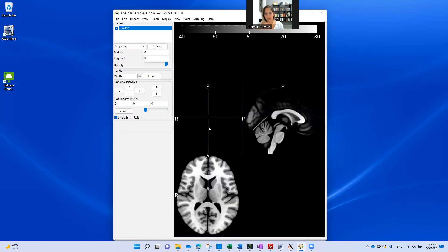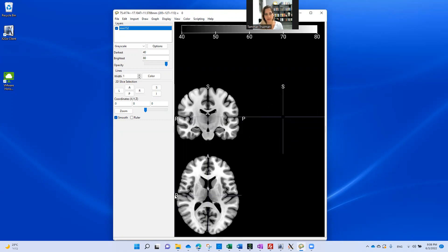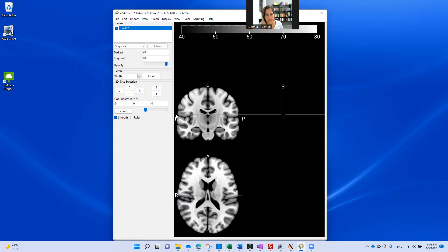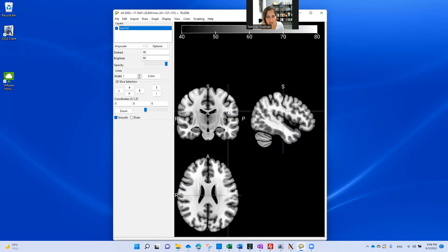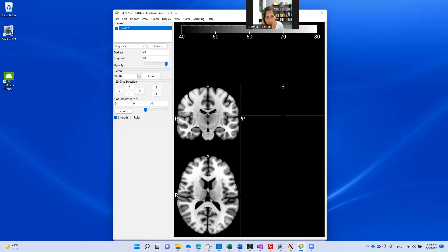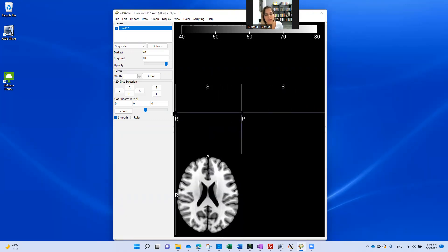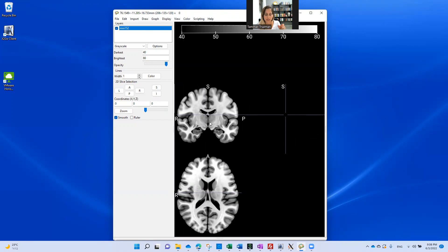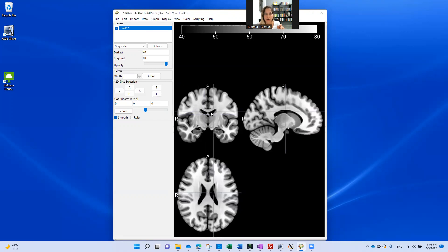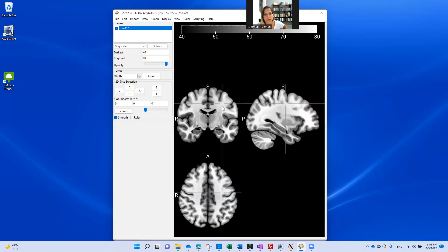The same for the other dimensions. Now, if you look at these numbers, they are representing the number of voxels. My image has dimensions, and if I continue with the X dimension, you can see that I start from voxel number zero and going all the way up to voxel number 206. This is the number of voxels in X dimension. This number represents the brightness of a specific voxel that my cursor is on. If I'm on the CSF, it's pretty much dark. If I'm on the white matter, you can see it's very bright.